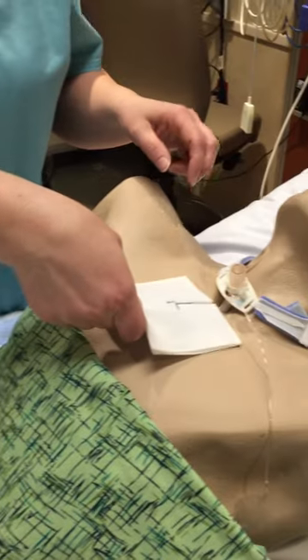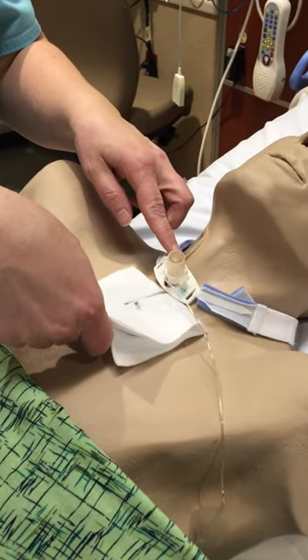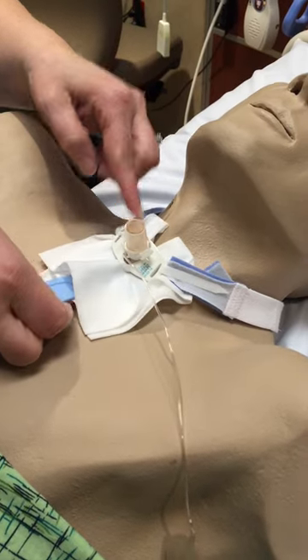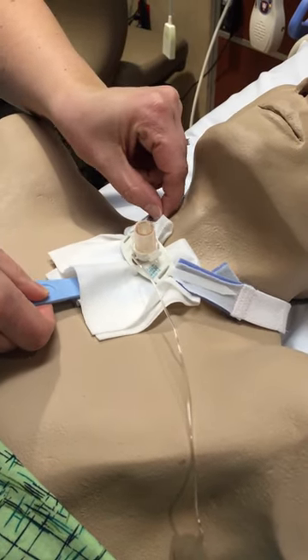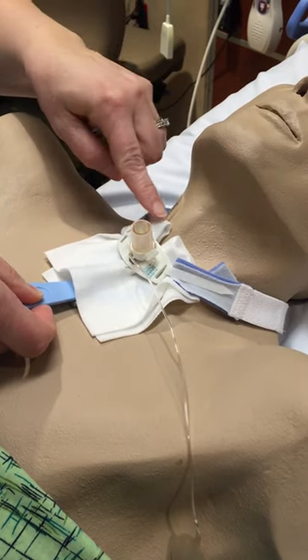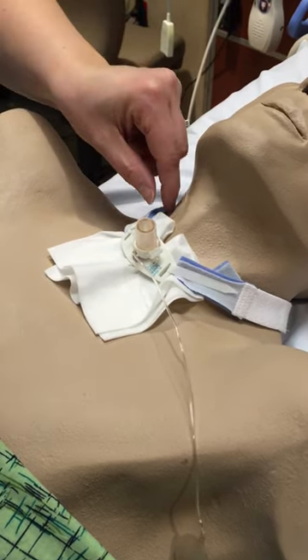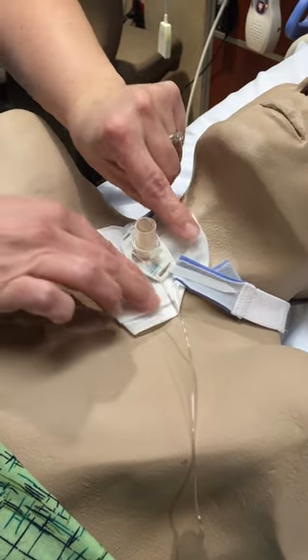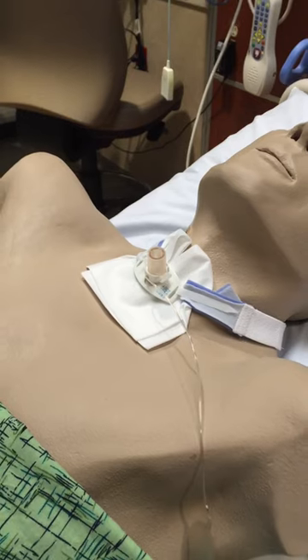Next, we'll come over to the tracheostomy and we'll slide the dressing underneath the trache plate, ensuring that the two folds of the dressing are above the trache plate. Remove the tracheostomy dressing applicator, adjust the dressing as necessary, and your trache care is complete.